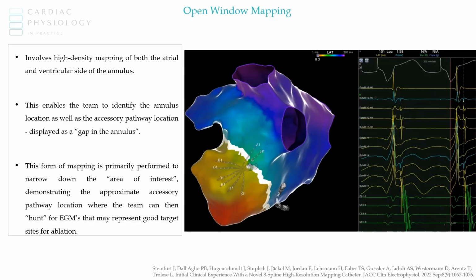to a stable reference. So if we have an accessory pathway in the left posterolateral position on the left atrium, here we can see an accessory pathway, and we're performing RV pacing. So we're performing retrograde mapping of this accessory pathway. During RV pacing, we'll have conduction from the RV, and it will travel through the accessory pathway, and then depolarize the rest of the atrium like this.